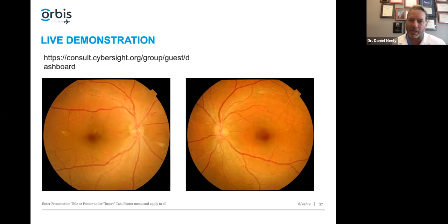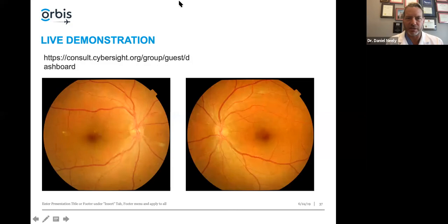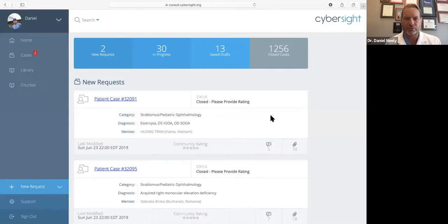Now let's try to do one live — fingers crossed. These are the images I'm going to submit for automated interpretation in real time. This is a diabetic patient; you can see some abnormalities there already. I'm now going to stop sharing the PowerPoint and start sharing my desktop straight into CyberSight.